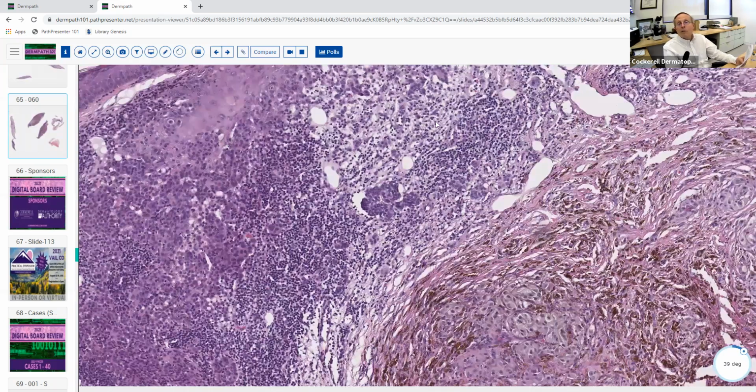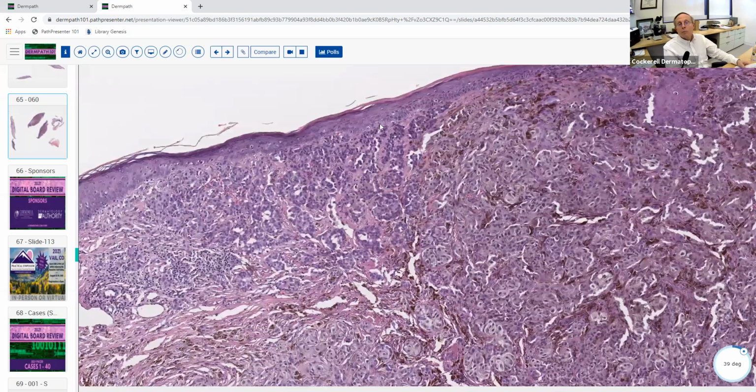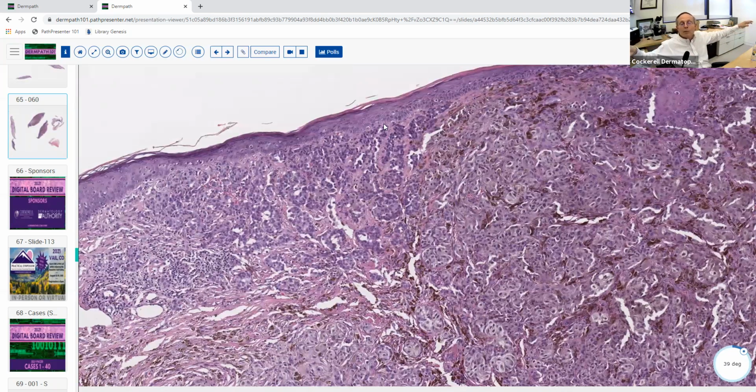And one of the interesting things about nodular melanoma, and over here you do have some epidermal involvement, is that Wally Clark years ago used to talk about radial and vertical growth phase, and talked about, well, melanoma will grow in the epidermis in a radial fashion for many years, then finally it develops the ability to grow down into the dermis. And when it does that, it's got a bad prognosis. Some people still believe that, other people are not so sure. I think with new genetic testing, we found that some melanomas have abnormal genetics when the melanoma is still in the epidermis and looks the same when it gets into the dermis. Others sometimes do change. So there's probably some truth in it, but it doesn't happen in every case.